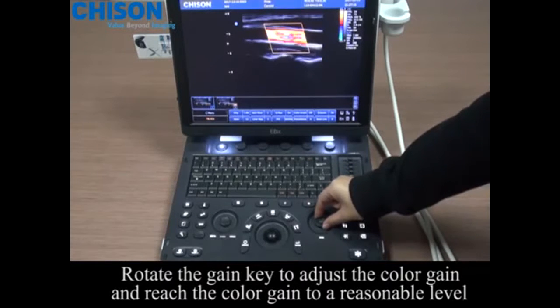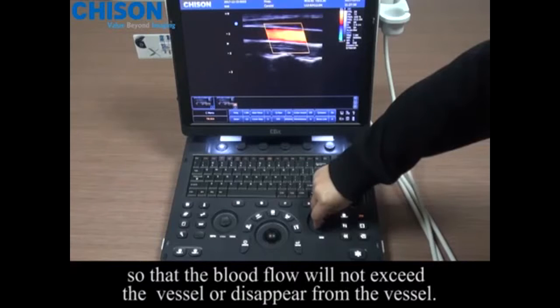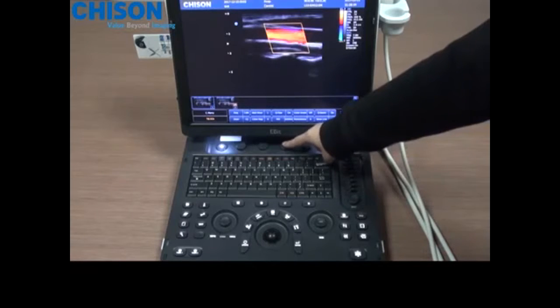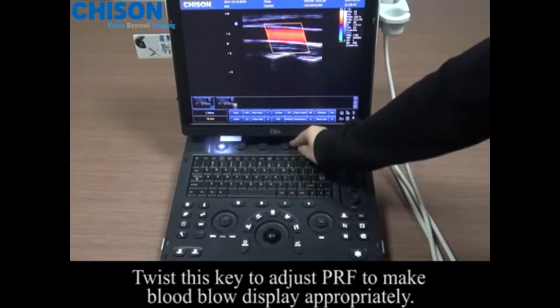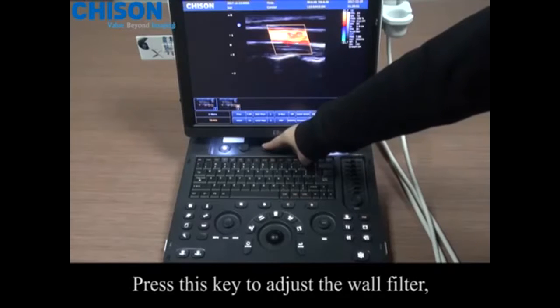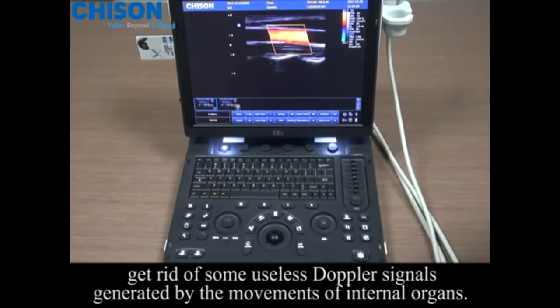Rotate the gain key to adjust the color gain and reach the color gain to a reasonable level, so that the blood flow will not exceed the vessel or disappear from the vessel. Twist this key to adjust the PRF to make blood flow display appropriately. Press this key to adjust the wall filter. Get rid of some useless Doppler signals generated by the movements of internal organs.